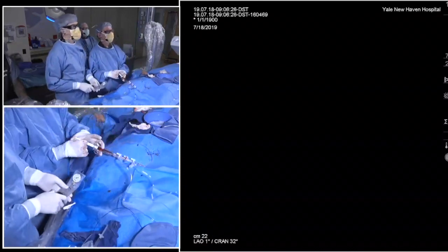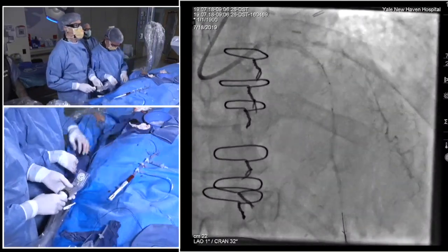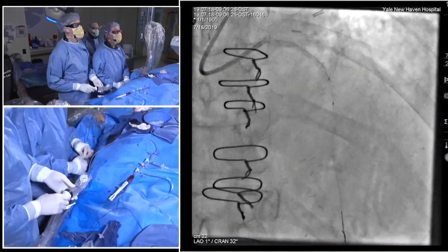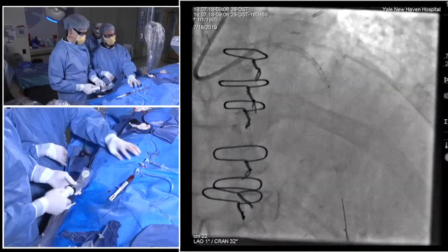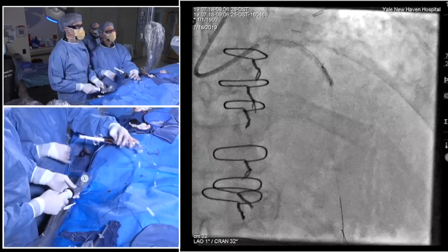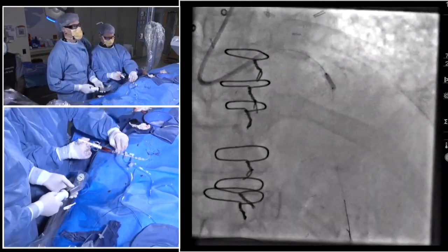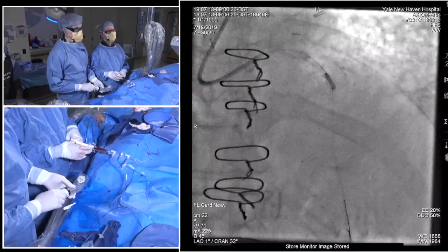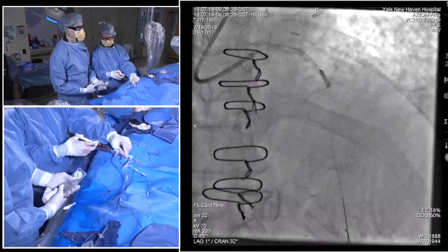Fluoro? Come back in here. So we're trying to stay within the segments that we roto'd just to start with, so we don't cause any further damage. Fluoro? So we'll go up to relatively low pressure, like 8 atmospheres or something, just to make sure that we get full expansion. Now, Kate, that's 4 atmospheres right there. Fully expanded at 4.